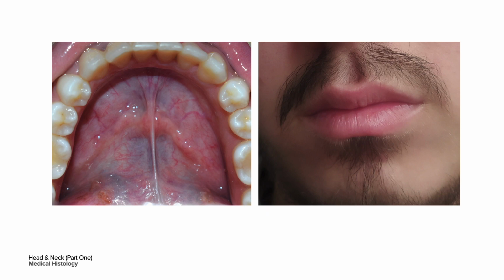Rete ridges are present. There is also pigmentation, which is composed of melanin, which is endogenous, and foreign, exogenous, like when you eat something that has tint or dye. Non-keratinocytes are melanocytes, Langerhans cells, Merkel cells, and lymphocytes.